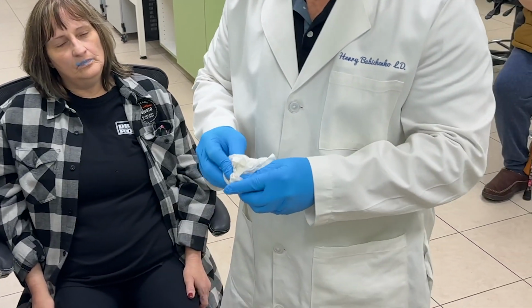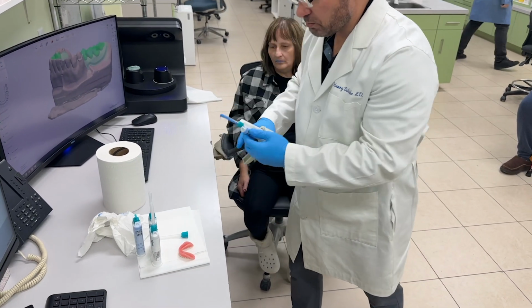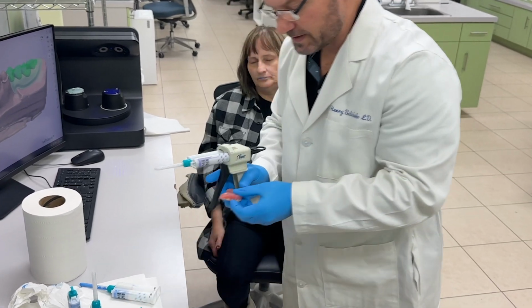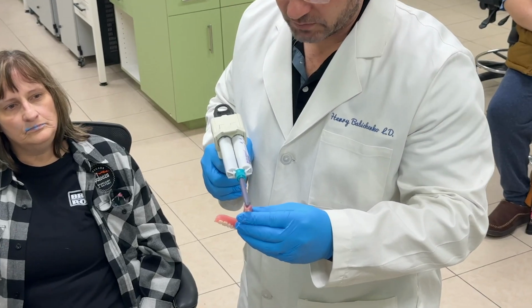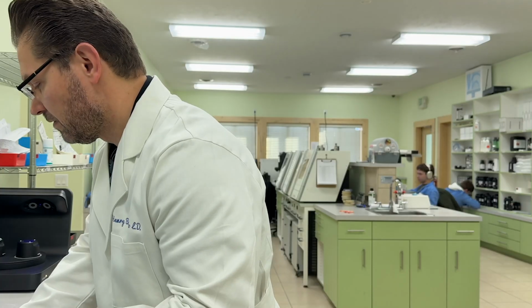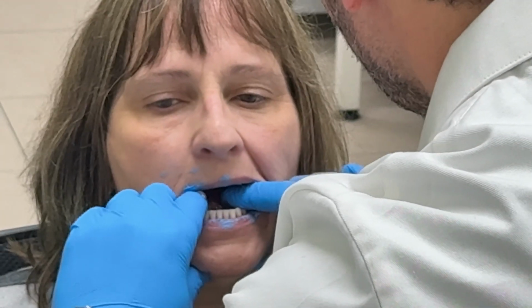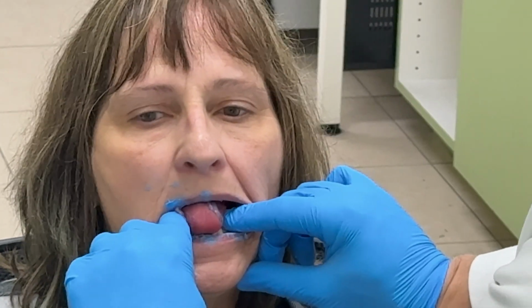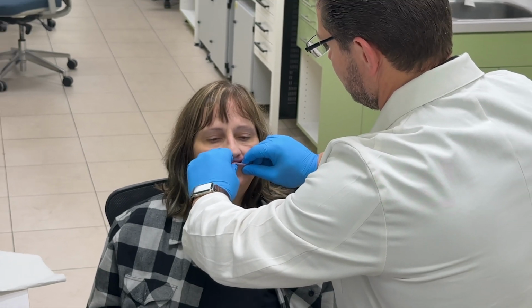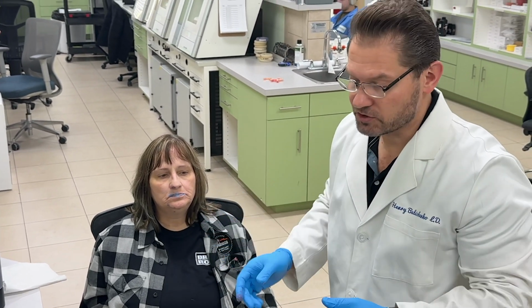Same thing, you're going to apply a denture adhesive, or not a denture adhesive, a tray adhesive. For the lower, we're going to use more of a heavy body impression, because the impression can escape from the lingual side of the denture as well, and therefore a heavy body will be a better impression in this case. Place this in the patient now. And bring your tongue out. Put it back. Close down, easy. And then we're going to move the muscles. The same thing, go ahead, move, and it goes down. So this gives us a functional impression.